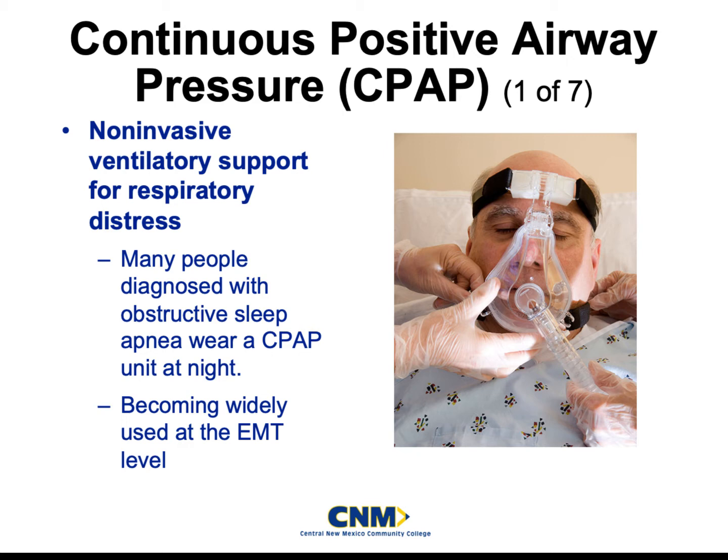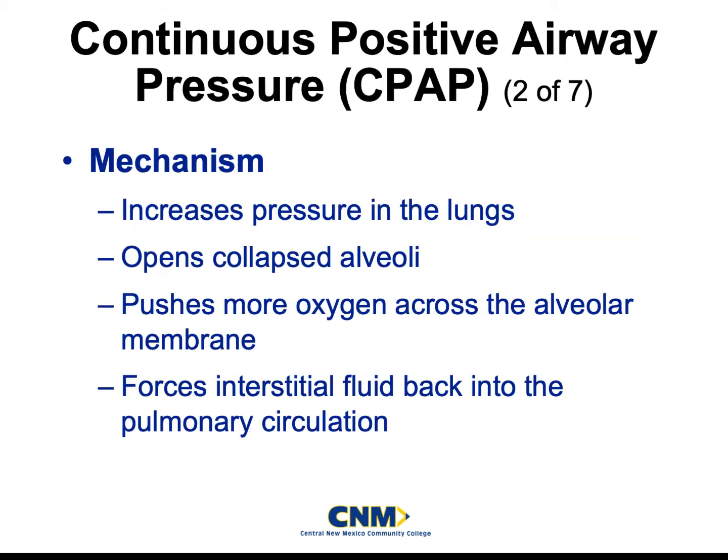You guys can nebulize medications through this. You guys can also nebulize medications through the BVM. But this is really a machine that has been a game changer for all of us in EMS, including all the way up to intermediate and paramedic. And it's really saving us from having to actually intubate or drop one of your supraglottic airways into our patient if we are able to get this machine on quick enough. And we do have certain parameters in place for our patient, and we'll talk about that as we go through this lecture.